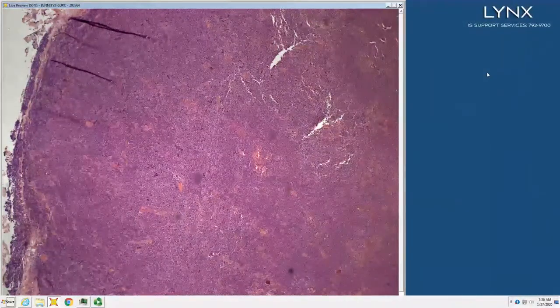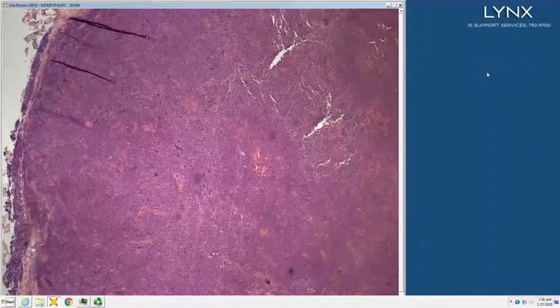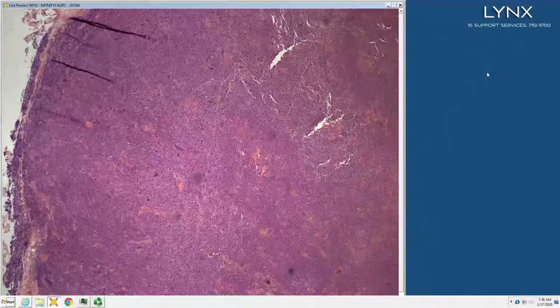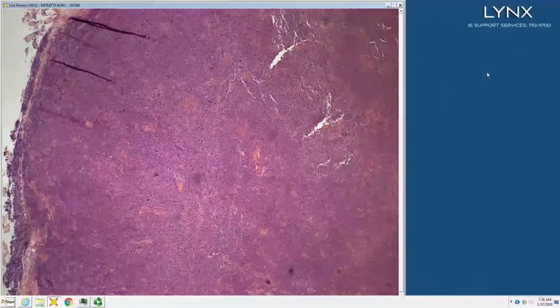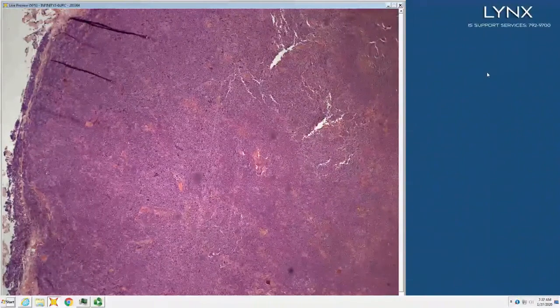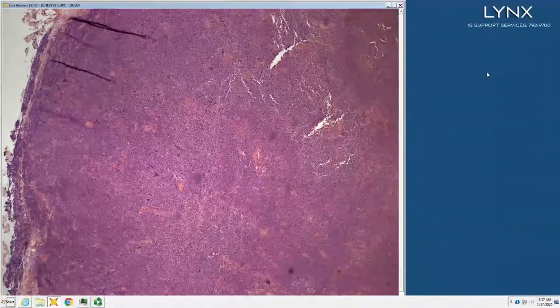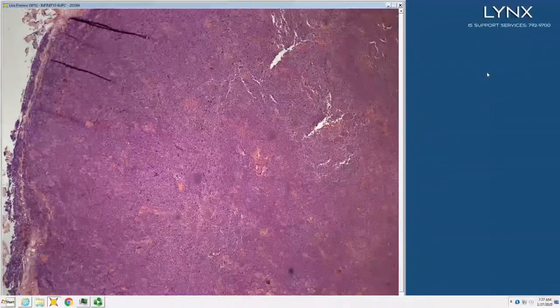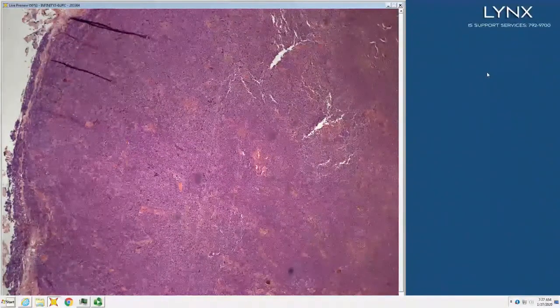You're then going to look at markers, right? So CD20 positive, what does that mean? B cell. CD79A positive, what does that mean? B cell, and it begins earlier and stays later in the life of a B cell.